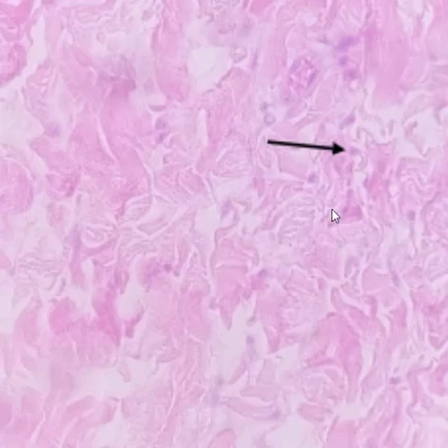So again, you have collagen fibers. And if you look, you'll see the little cells that are laying down the collagen fiber. And when you see fibers being laid down, you know that the name of the cell is a fibroblast. A fibroblast. They make fibers. So the name's right there in the word fibroblast. It provides resistance against tensile forces in many directions. So basically it lets your skin move in different directions. That's what it's saying. And so if you put pressure on the skin, it's not going to be ripping.